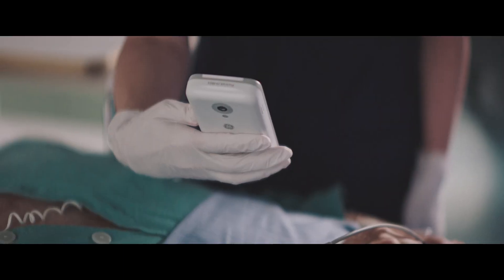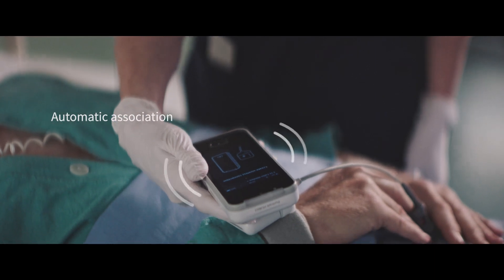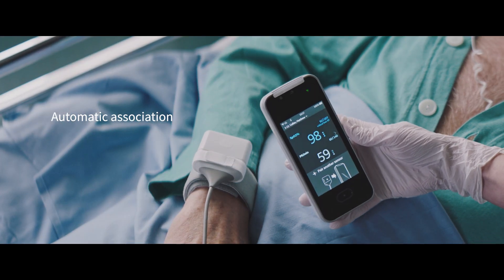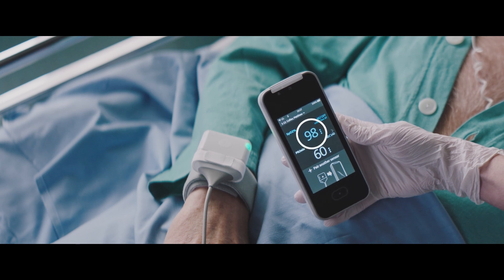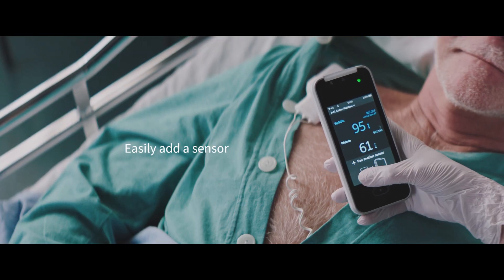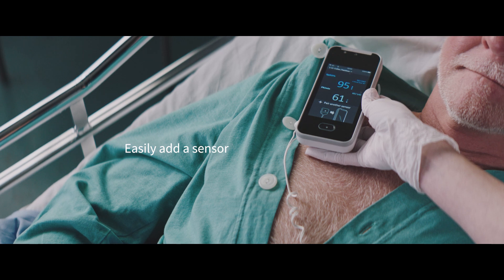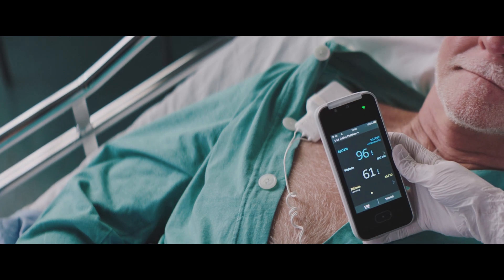To start monitoring, the nurse simply places the patient monitor in close proximity to the sensor battery. A vibration signals a successful association and the parameter is shown on the monitor's screen. The nurse then selects the plus sign in the bottom left of the patient monitor's screen to initiate the association for the second sensor. It does not matter which order the sensors are added.